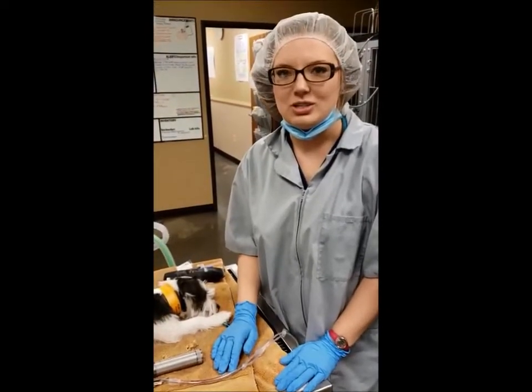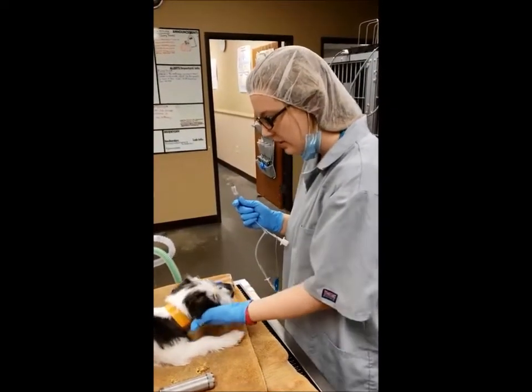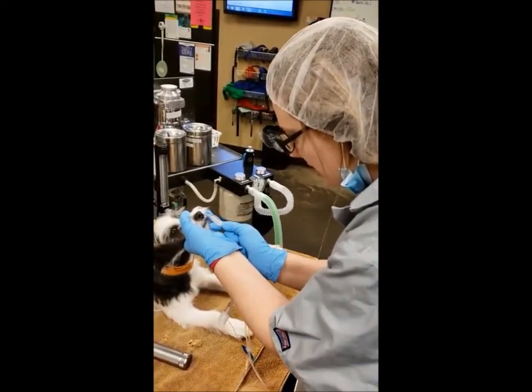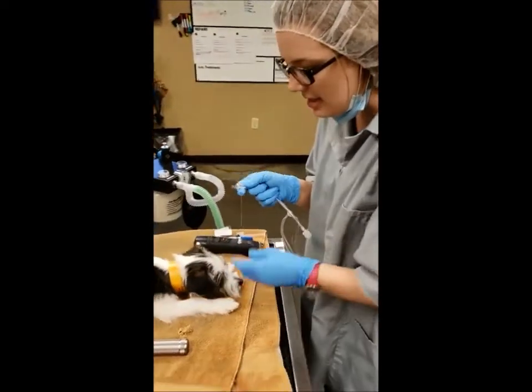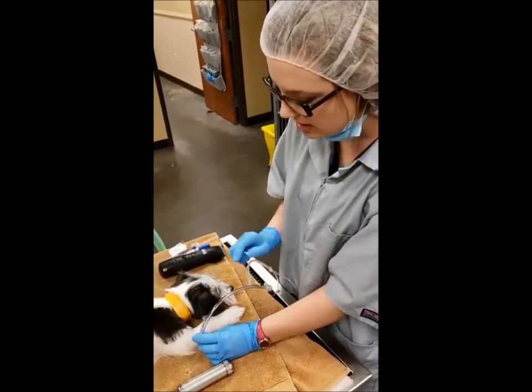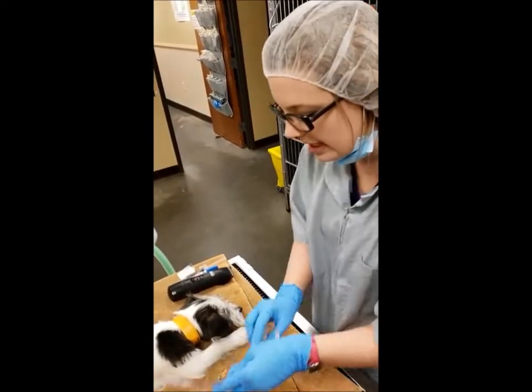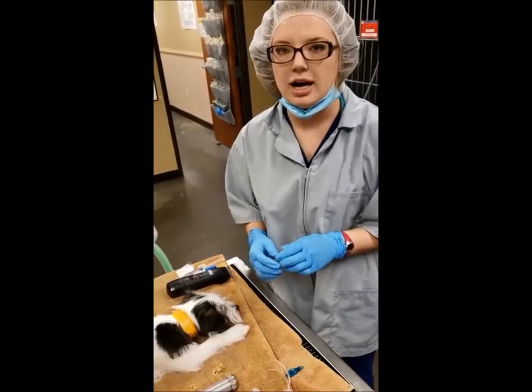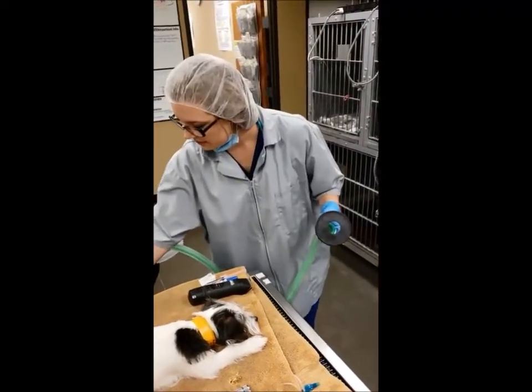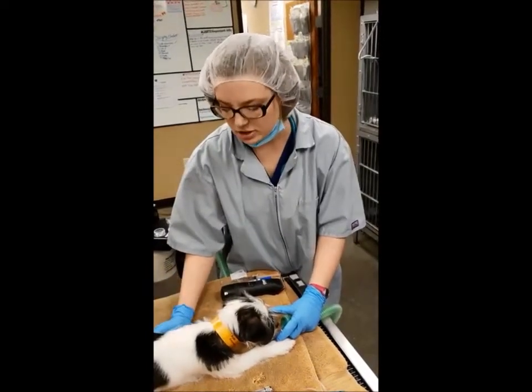Okay, I'm getting ready to induce our patient for his neuter. I'm going to go ahead and measure his ET tube. And so to measure the diameter, you want to see if the tip of this is the width of his nose. And it is. And then you want to make sure that length-wise it's good, and so you would measure it from the mouth to the thoracic inlet. And so, looks like this is going to be the perfect size. Before I place his IV catheter and before I give him the propofol, I'm going to pre-oxygenate him for 5 minutes. And so, we'll come back in 5 minutes after this patient has been pre-oxygenated.